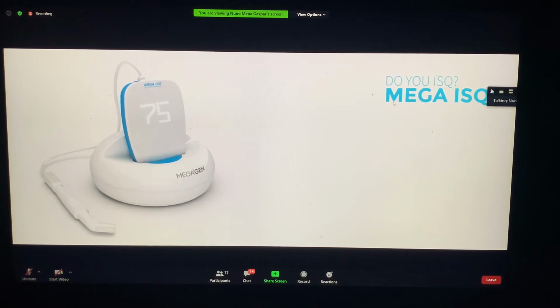Insertion torque value is something dynamic. When you place your implant, and after 5 minutes it's different. After 1 hour it's different, and you don't know if it will be enough or not to place a prosthetic over it. So that's why you should use something like ISQ reading.